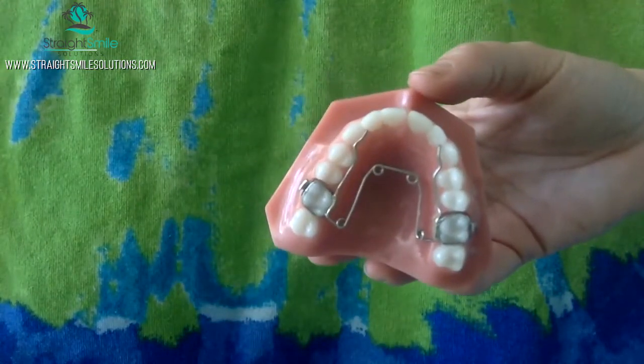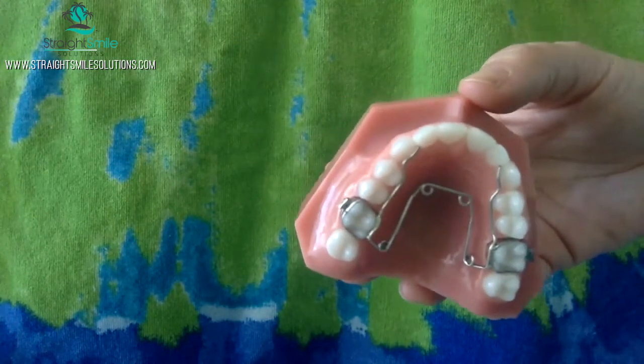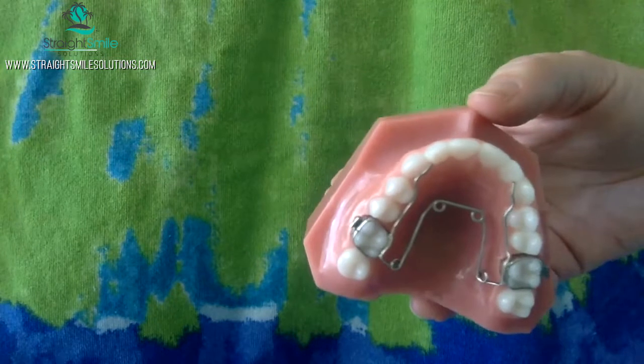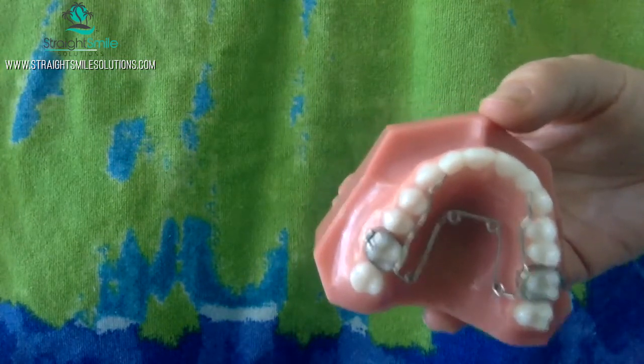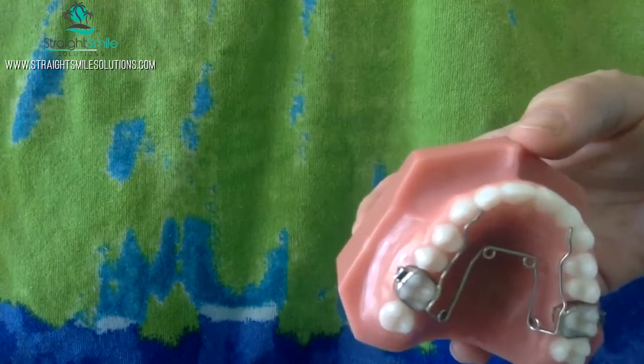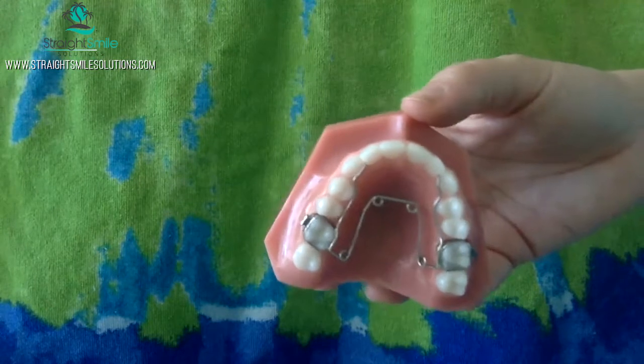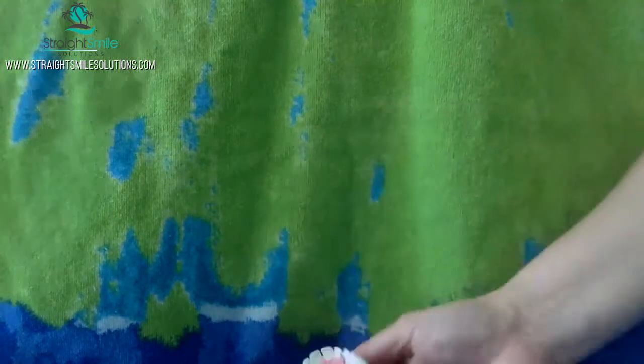It does leave a pretty gnarly imprint on the tongue. It's not the most popular appliance because you definitely get some discomfort on the tongue initially and you can get some cuts. So you want to make sure you pick the right patient and brief them accordingly. Basically, you're going to go ahead and order a QuadHelix appliance, and you can go ahead and deliver these in adults too — that's totally fine for adults with a crossbite or a narrow upper arch.